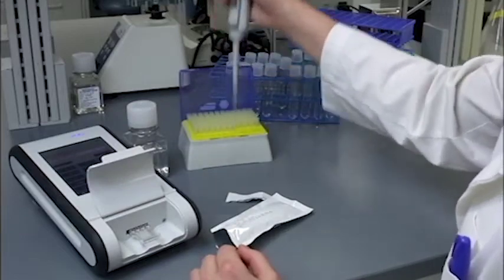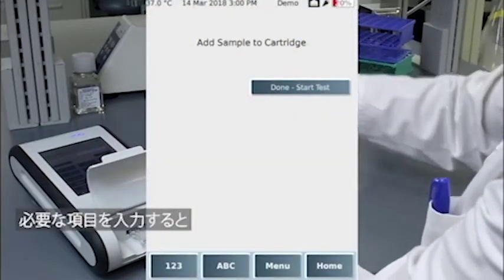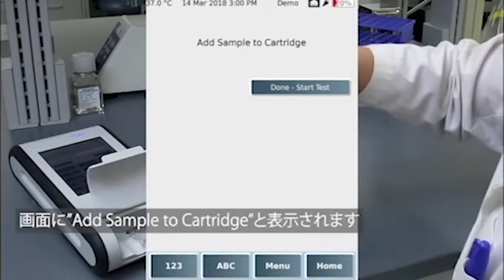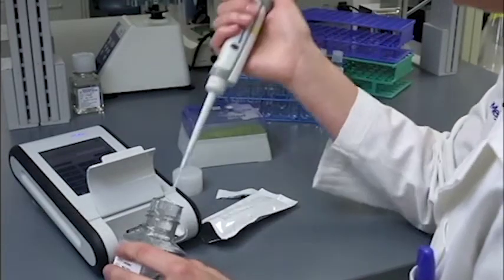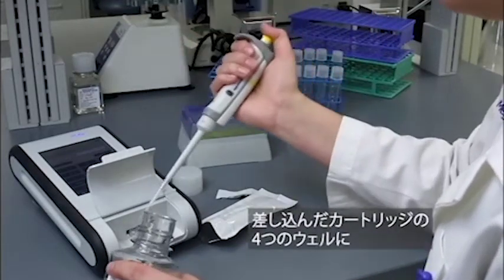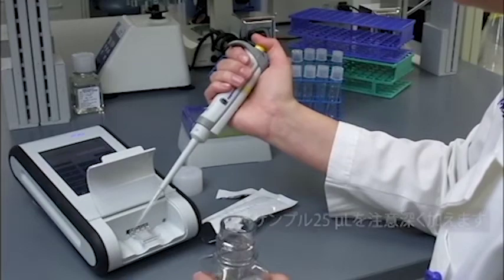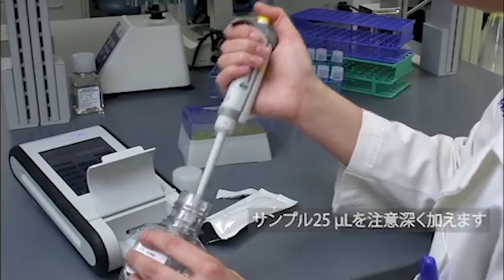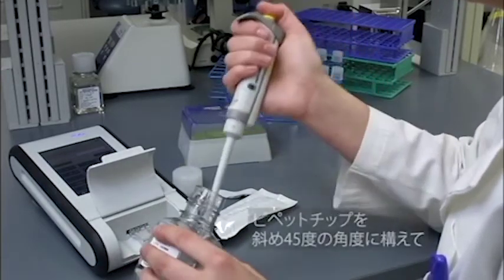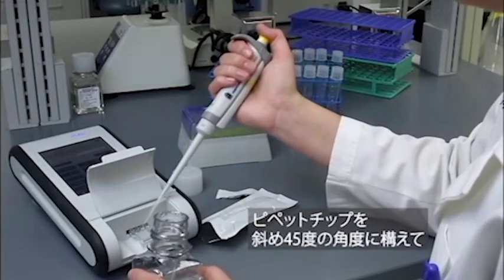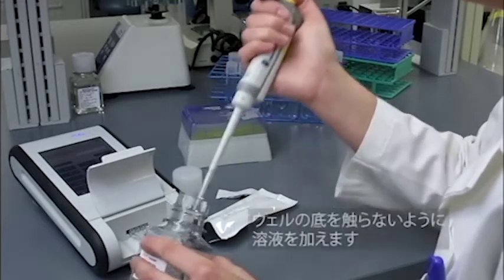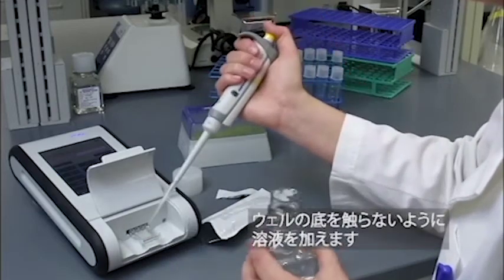Once the necessary values are entered, the reader will display a prompt to Add Sample to Cartridge. Carefully pipette 25 microliters of sample into each of the four sample reservoirs of the inserted cartridge. To do so, hold the pipette so that the tip is at an angle and not completely at the bottom of the sample reservoir.